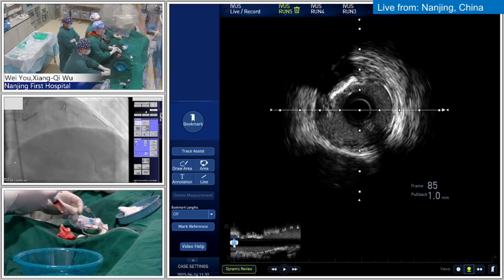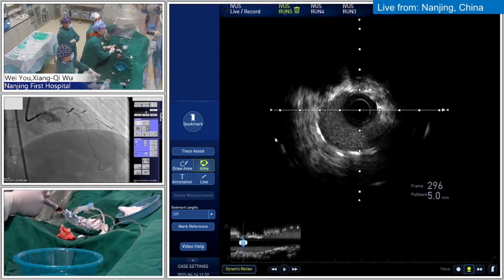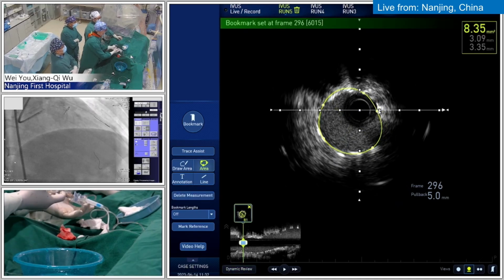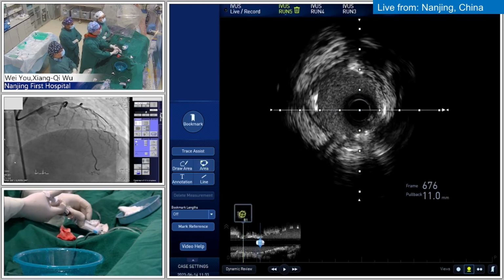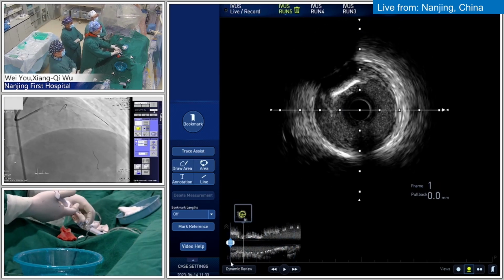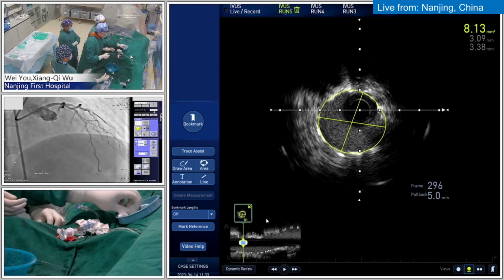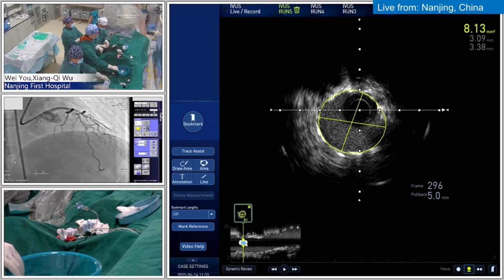Yes, that was not angiographically apparent. It's very clear. A lot of overlapping there. You don't really appreciate much of that. I think going with the IVUS is the way. I just insert a bit more. I use NTG again. I think this one is more distal. More distal. Okay. Agree with you. Thank you.